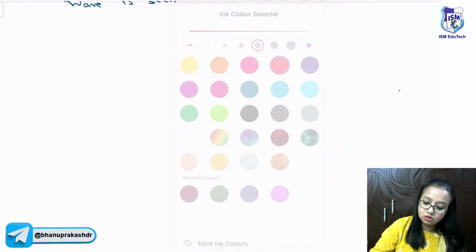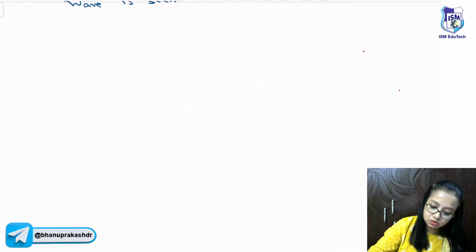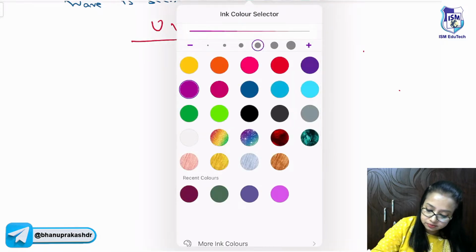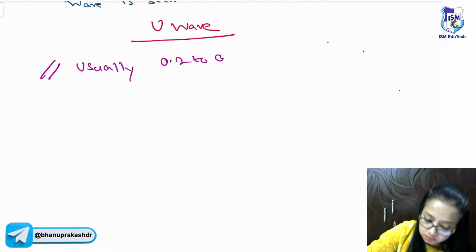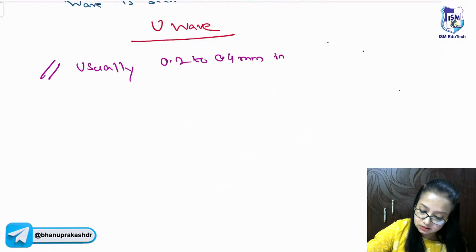U wave is also equally important. So, U wave, what are its characteristics? It is usually 0.2 to 0.4 millimeter in size.